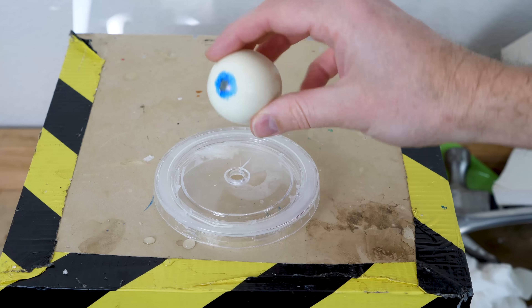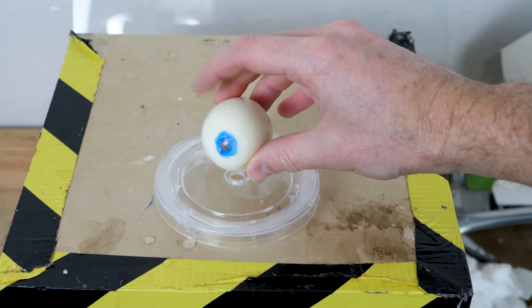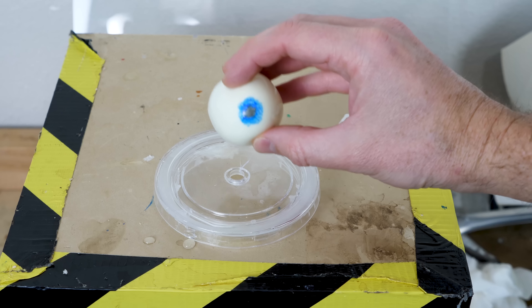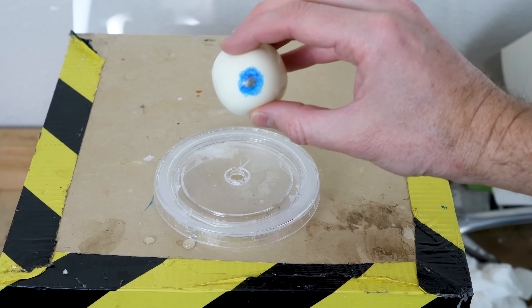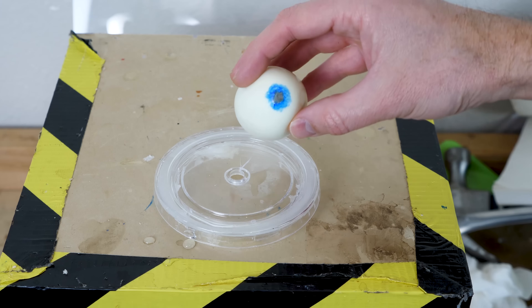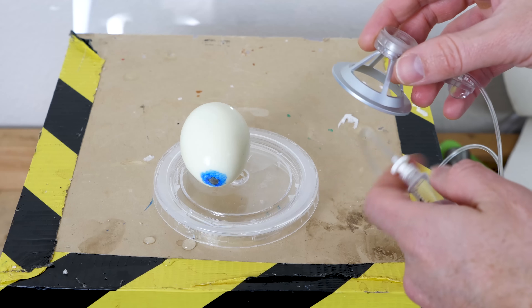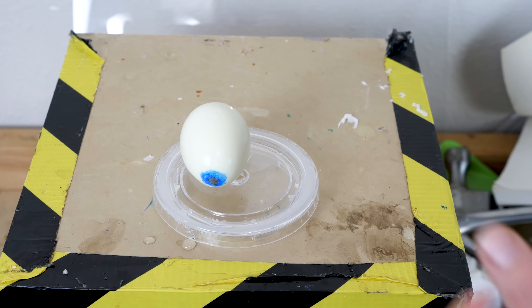To show you how this works, first I'll perform my own LASIK eye surgery on this eye here, which is actually an egg, and then I'll show you the performance of a real surgeon on my real eye in the operating room. I have the actual instruments that I asked the surgeon if I could keep from my own surgery.